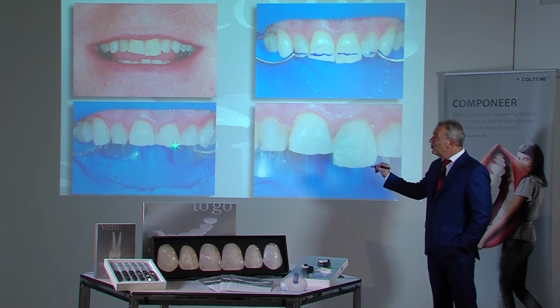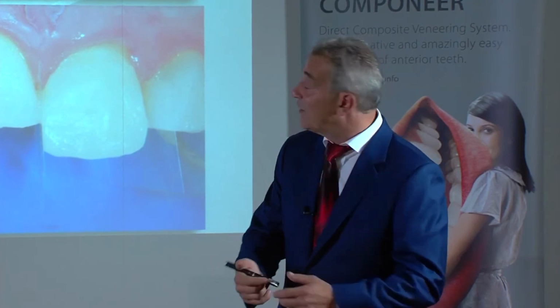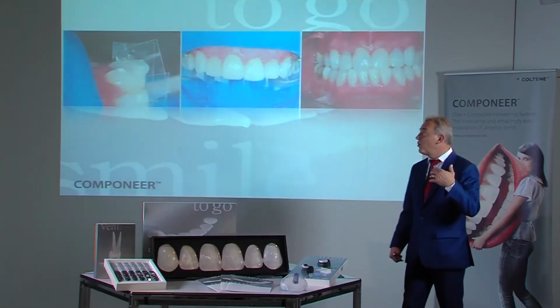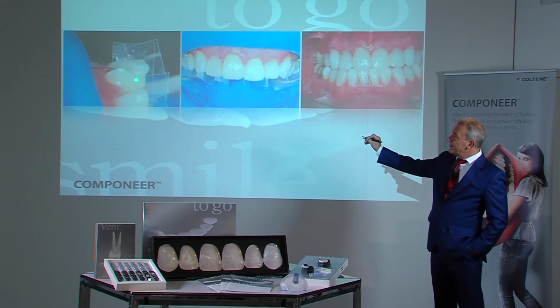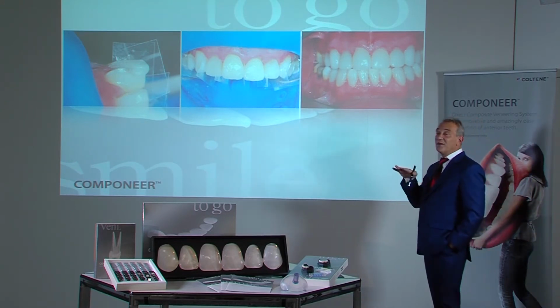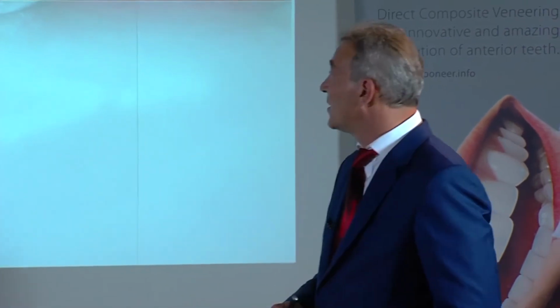In this region, one needs to build up a sort of curve. The incisors simply need to be brought forwards, and the incisal edge is transposed to buccal. One can see how much dentine mass is applied. That is a bulk of a good 2 millimeters. The incisal third will be built up by 2 millimeters and become longer at the same time. This allows transposing the incisal edge to buccal without becoming thicker.